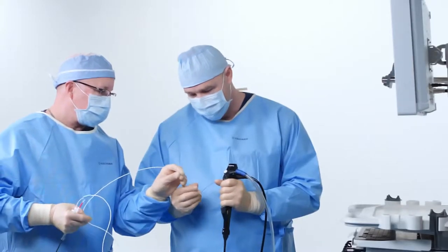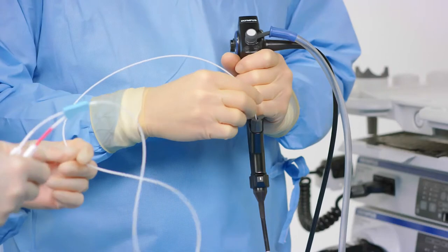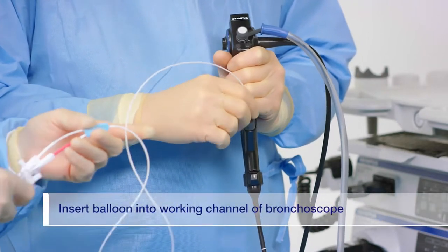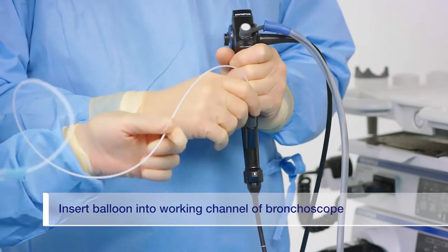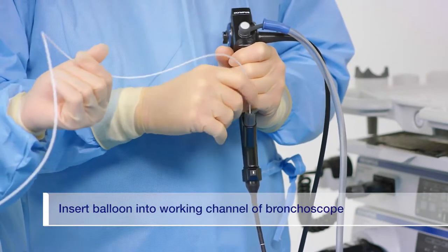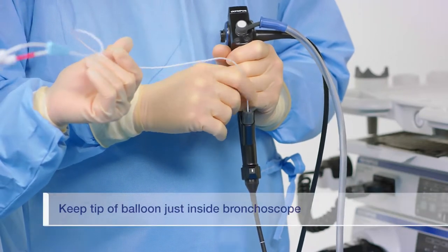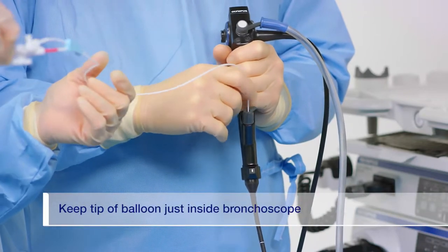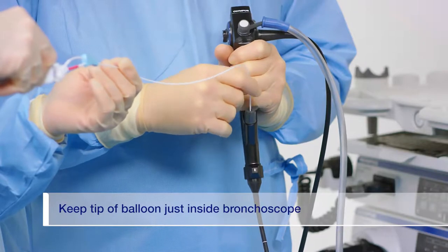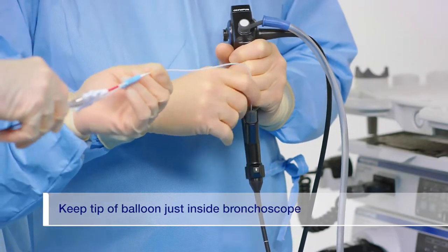To determine an airway size for appropriate valve selection, insert the deflated balloon into the instrument channel of the bronchoscope. Keep the tip of the balloon catheter just inside of the distal end of the bronchoscope while maneuvering to the selected airway.